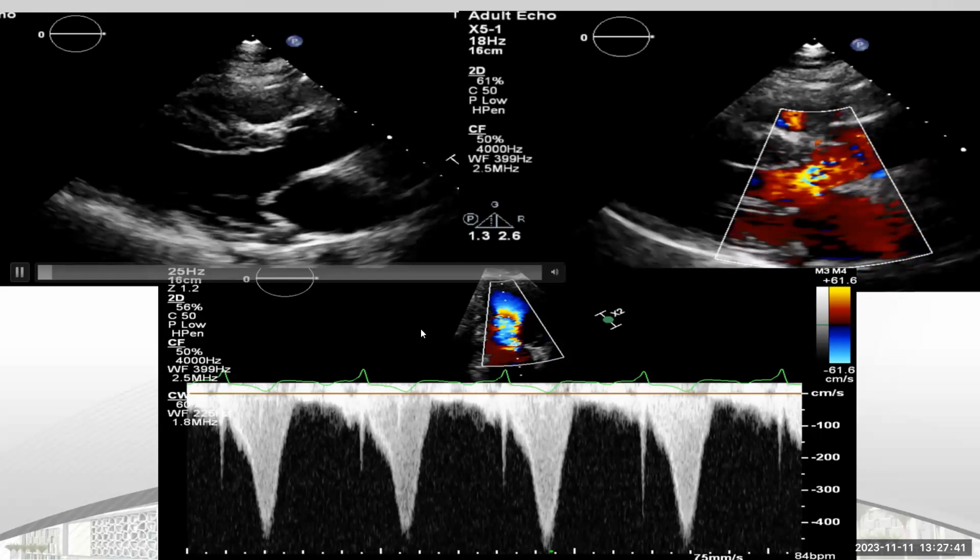Okay, anybody can comment about this? This is a very important point. We have to comment about it. Is the interventricular septum 30 millimeters in HOCM? The answer is no, not always. Yes, this is one of the criteria for primary ICD.